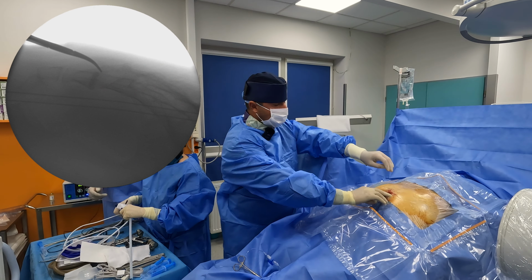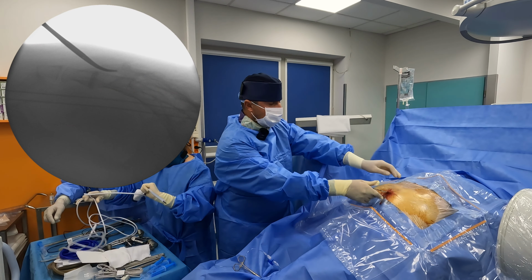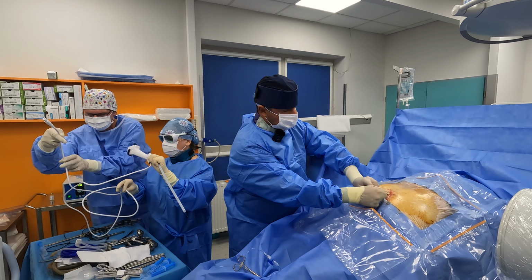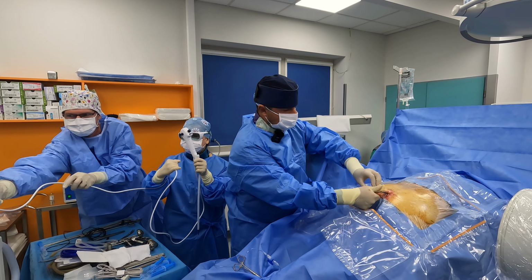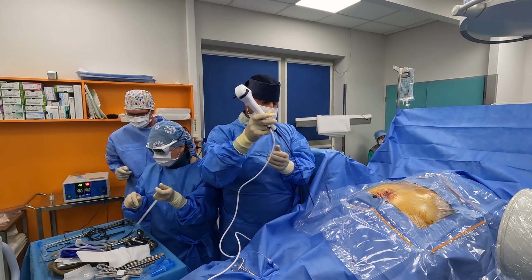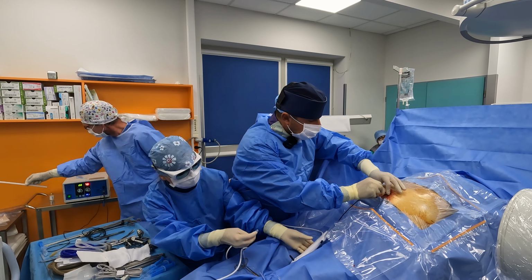Okay, and now I'm rotating the forceps with the face up and lifting up the sacrococcygeal ligament. I can do it a little bit to the sides as well, just to prepare the correct position for everything. The final step is going inside with the scope.